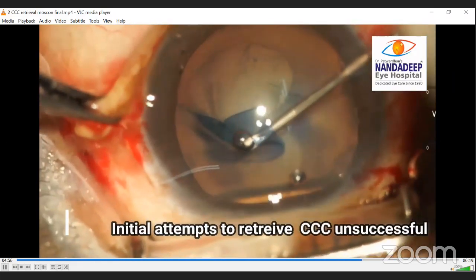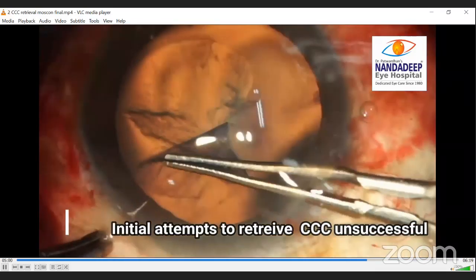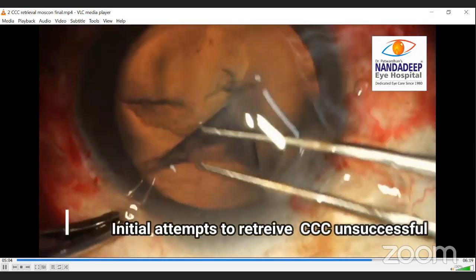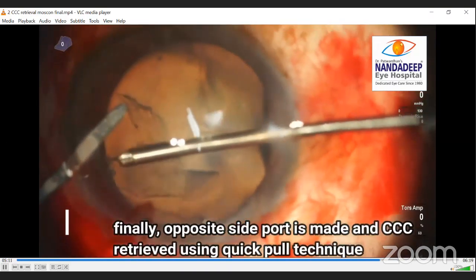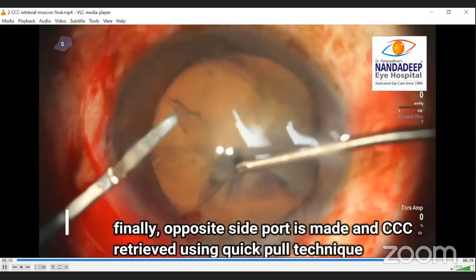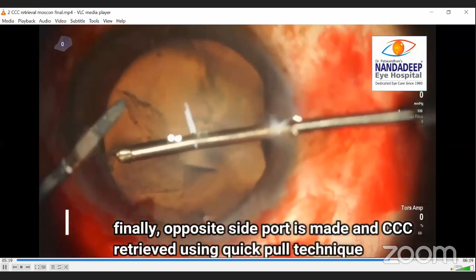So again, another case, the initial attempts, again you can see the mistake being done. Now you can see the surgeon is pulling it centrally, but not very quickly. So again, I am going from the opposite side, holding the flap and pulling it quickly. You can actually see the zonules got broken and then the Capsulorhexis came in.